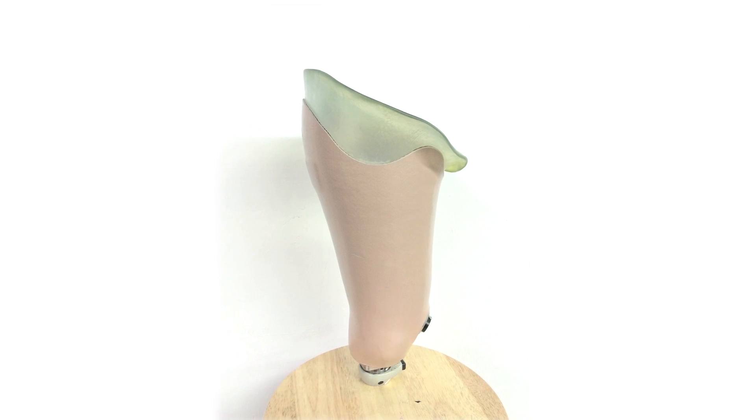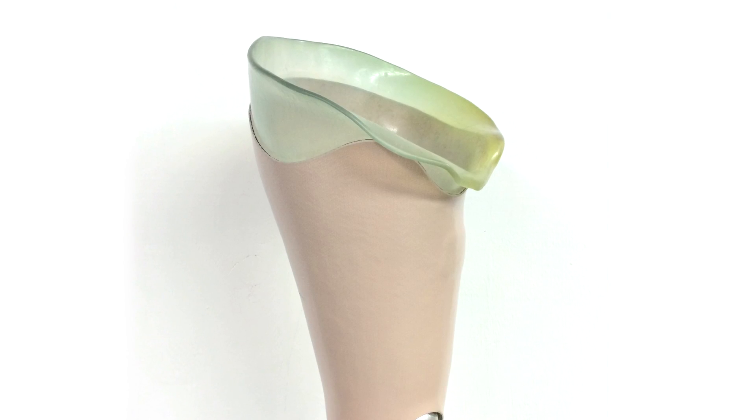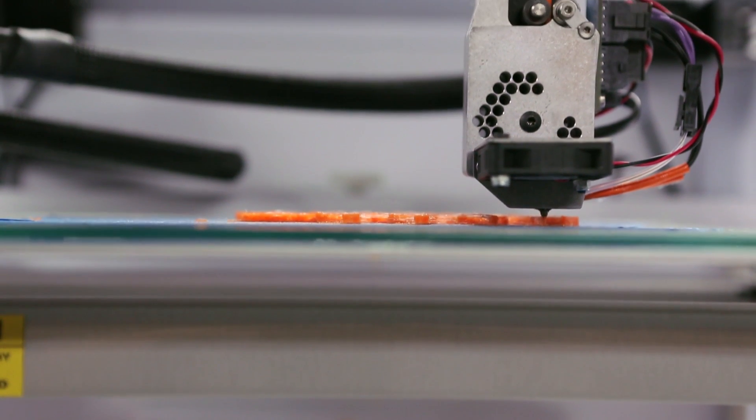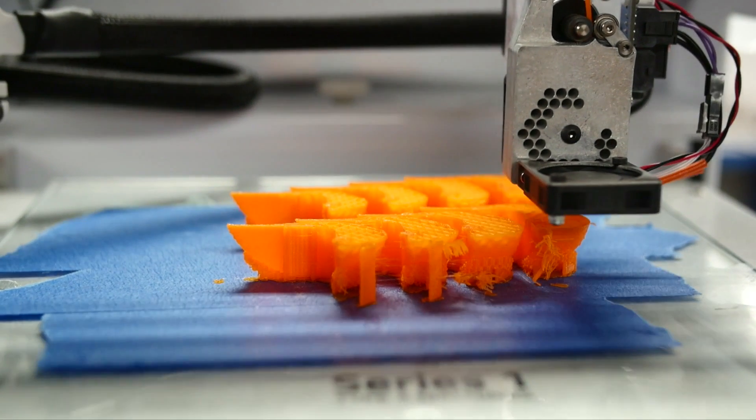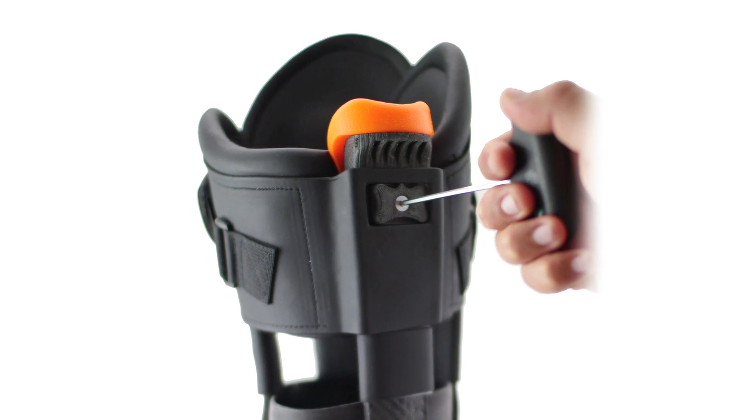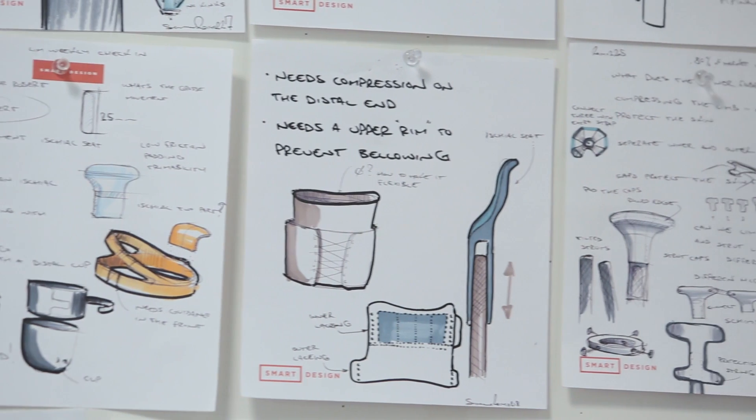In the traditional socket, this purpose is integrated into an entire frame. With the Limb infinite socket, we've essentially isolated that functional purpose into one aspect of our socket and tried to optimize it.